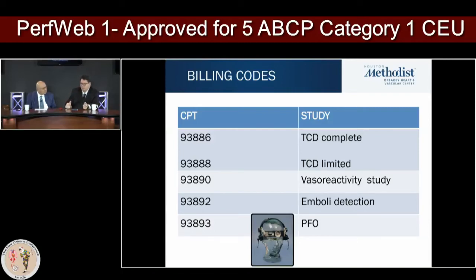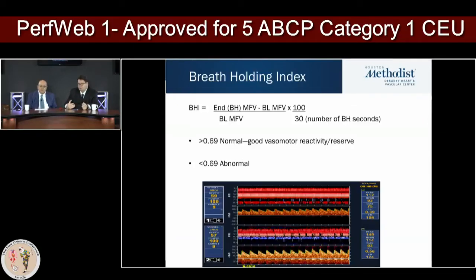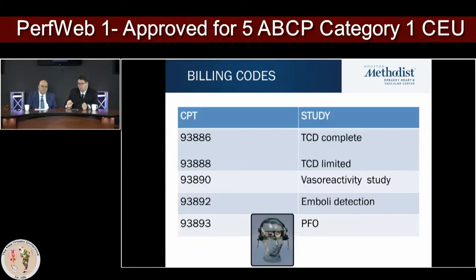Bilateral or unilateral doesn't matter. These tests are done in the sitting position, so your Valsalva maneuver definitely has a better effect, and we do not have to sedate. Without sedation you can perform a better Valsalva, and I think that also triggers a better response for us.